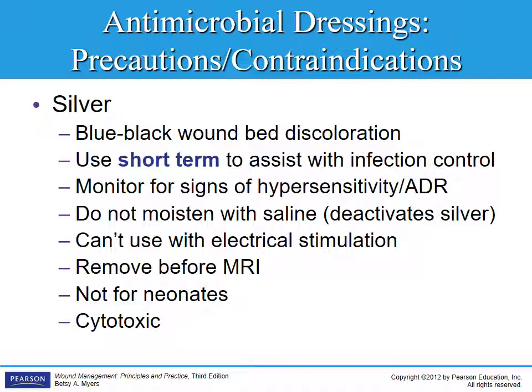Again, you can use it short-term to assist with infection control. You need to monitor for sensitivity, hypersensitivity, or an acute drug reaction. Don't ever moisten it with saline. A lot of times, when silver first came out, nurses were doing this. Because the wound bed itself was not moist enough, they would moisten the dressing, and that deactivates the silver. So you then have no antimicrobial agent on it because you've just deactivated the silver.